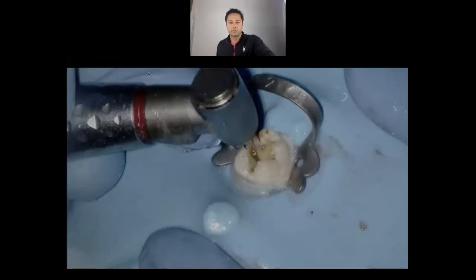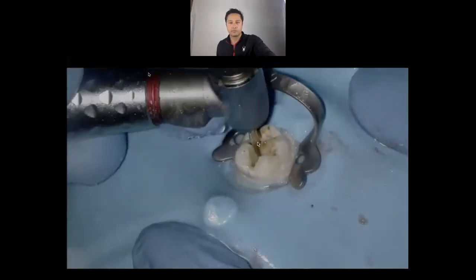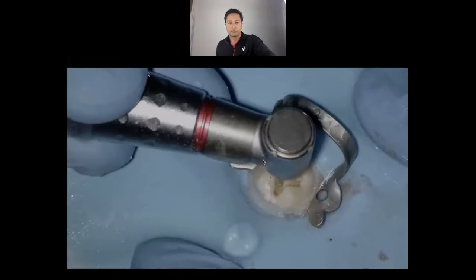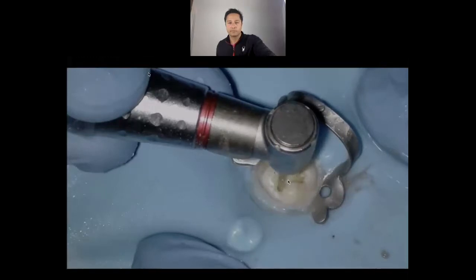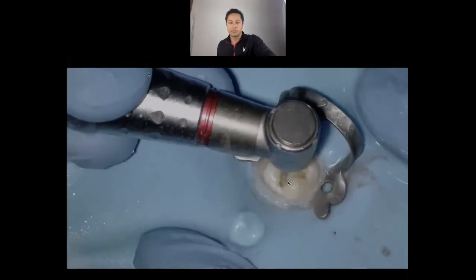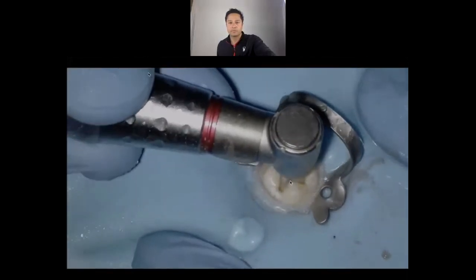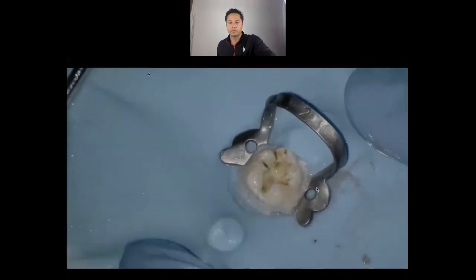I'm looking to see if I've dropped into the pulp chamber — I haven't yet. One of the things I always notice at the beginning is seeing that white. Before you hit the pulp chamber, you'll often see a little bit of bright white dentin. So we're going to pop right into that pulp chamber. This is a great time you can give your patient an intrapulpal anesthesia — that's the practice winner if the patient's in pain.